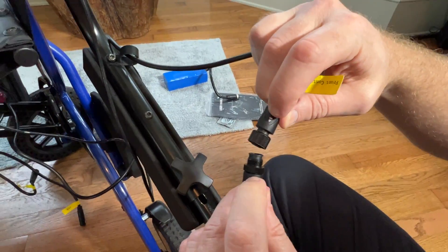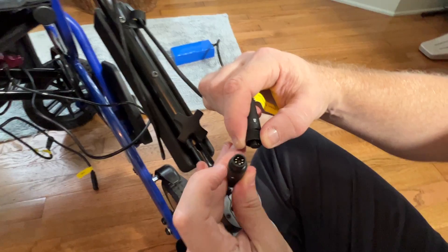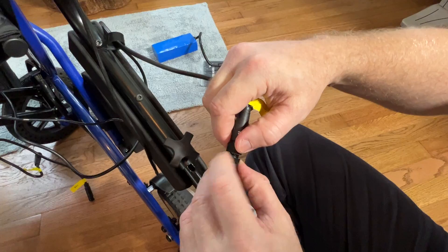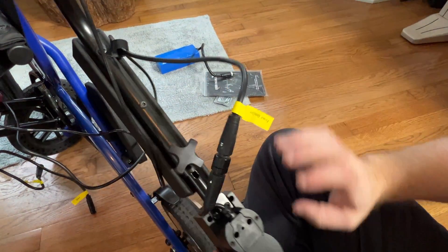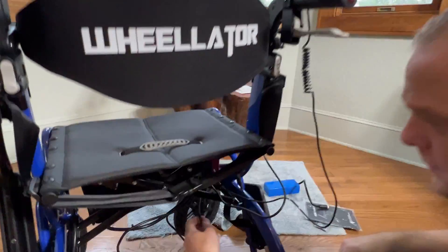So we see a left and a right connector, and there's the front joystick controller. We've got a key and some delicate pins there, so I want to make certain that I'm matching that up and connecting these two together. Now we have a back controller too, but we'll get into that in a moment. So we have the front controller connected.